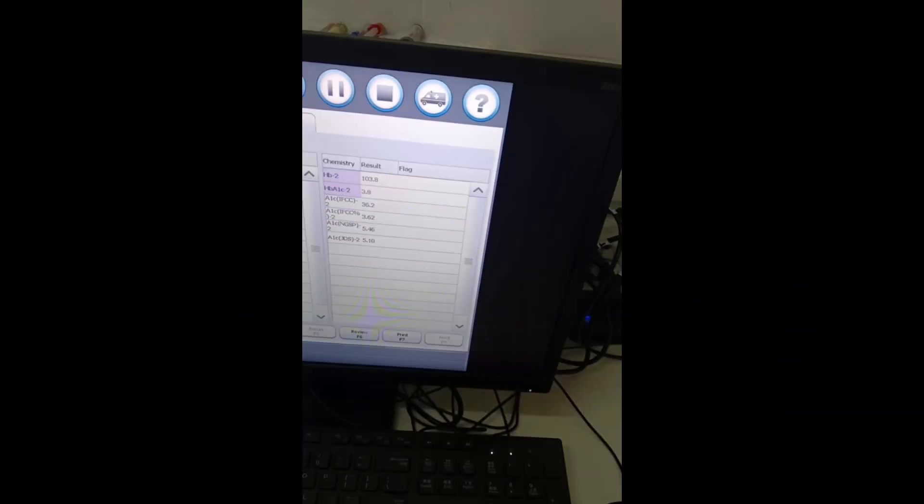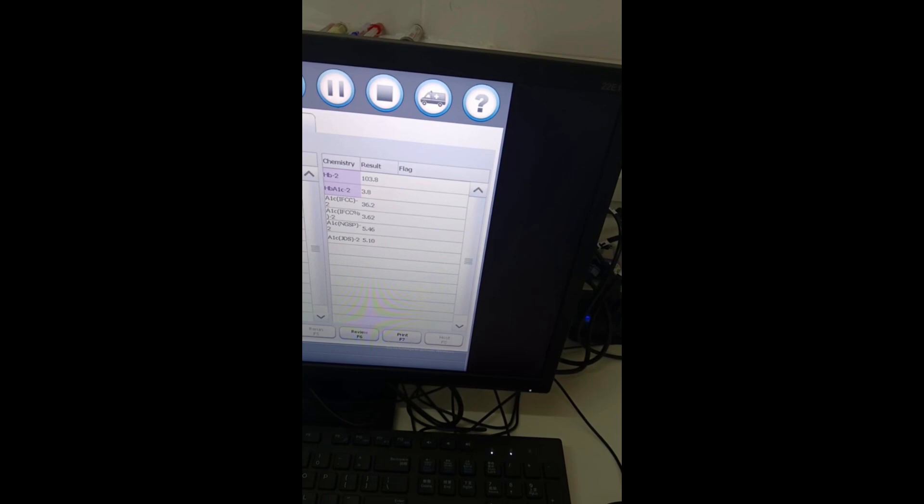After the test is done, it will display your results in this order. The first one is the Hb in micromole per liter, followed by the HbA1c also in micromole per liter, but you're not going to record all this. The next one is the IFCC value in millimole per mole. You can use that. Then it also gives you the IFCC in percentage. More importantly, it gives you the NGSP number in percent. That is what we usually record as the HbA1c value in percentage.